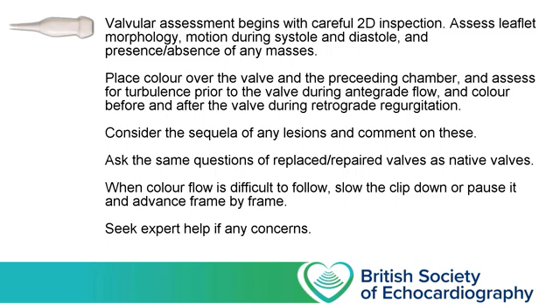When you're faced with a replaced valve or a repaired valve, the questions you want to answer are the same as those for a native valve. How does the valve function as a valve? Does it let blood through when it should? Does it prevent blood flowing backwards when it shouldn't?